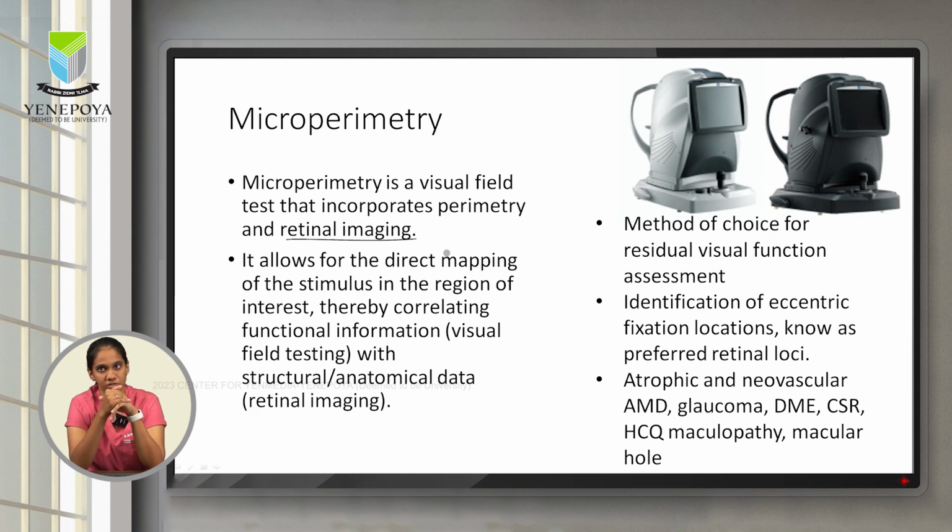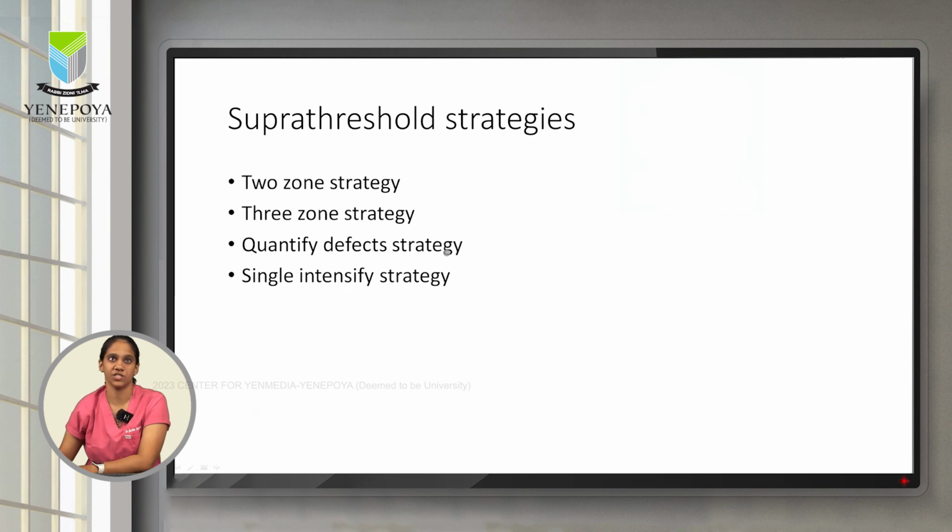You can use it in atrophic and neovascular AMD, glaucoma, diabetic macular edema, CSR, HCQ maculopathy and macular hole, where central fixation is not possible. There is an eccentric locus of fixation.